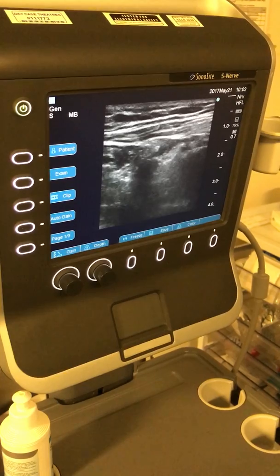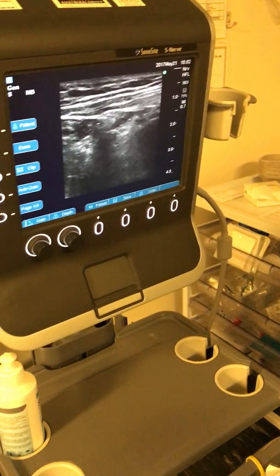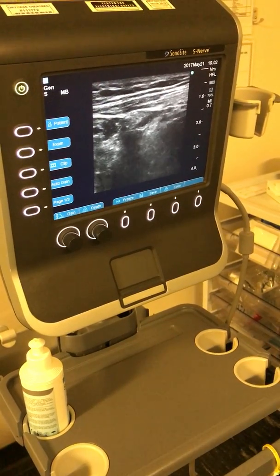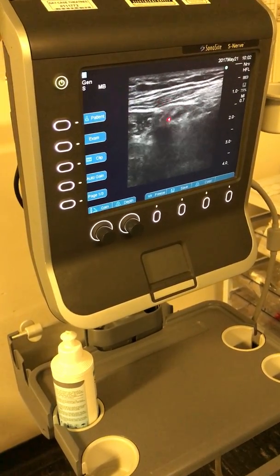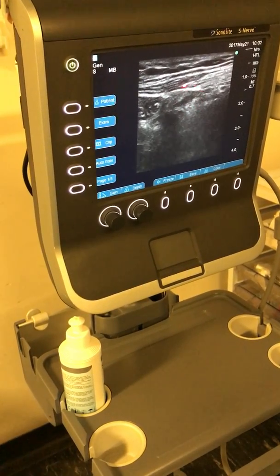The positions described by anatomical landmarks are usually lateral, and then you put the needle in and try to look for the quadriceps dancing, patellar dancing. But in this case, it may be anywhere, but your area of interest is this. Anything that looks like a nerve, you pierce the fascia and put the local anesthetic in that area.